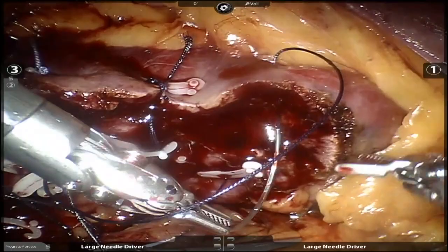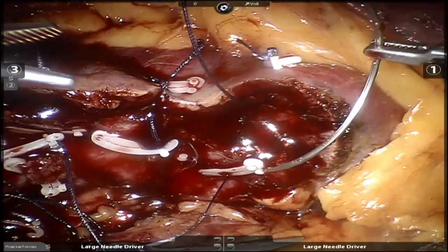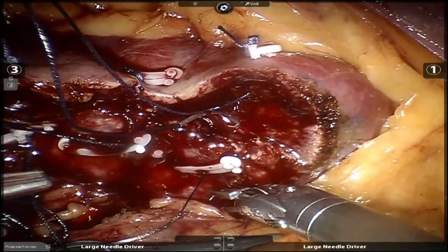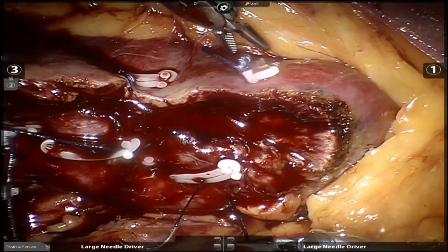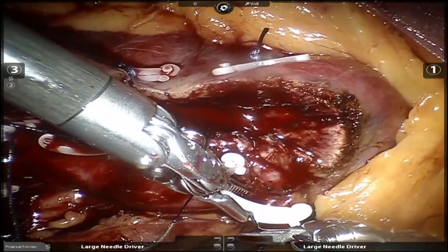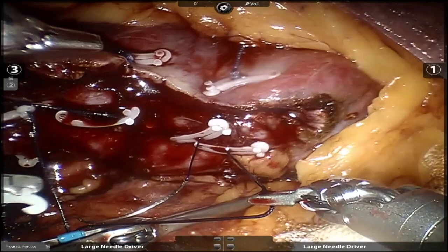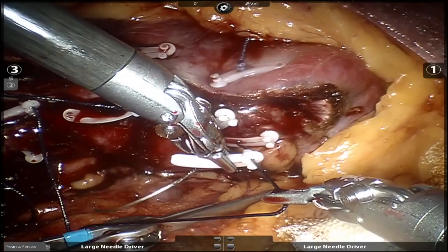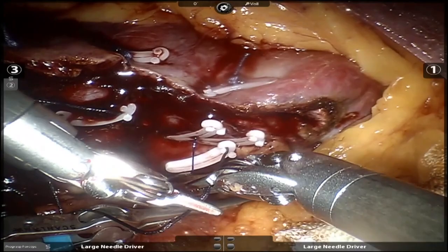So let's look at the defect. Let's look right there, please. Yeah, we'd love to get a suck right there if you could. That's it. Nice. I'm going to go a little deeper on that one. There we go. That's better. Give me one now. Hem-o-lok. Brandon, you don't need to write on the tissue. Pull back this way. There we go. Good. Thank you. I can slide it down. Okay, we're gonna look at that. We're just gonna go with those for now. Needle out.